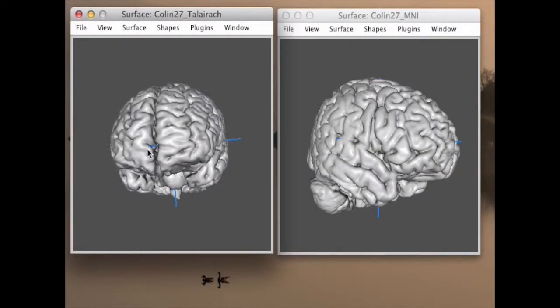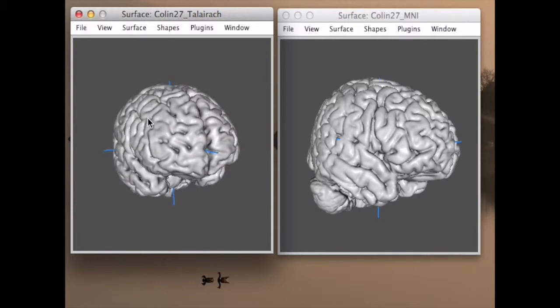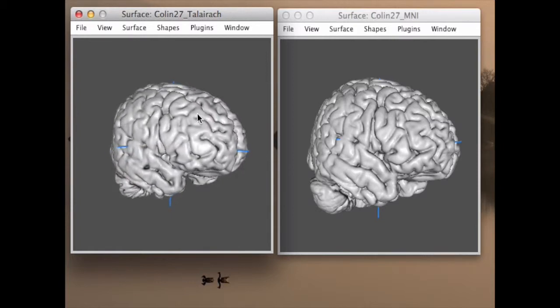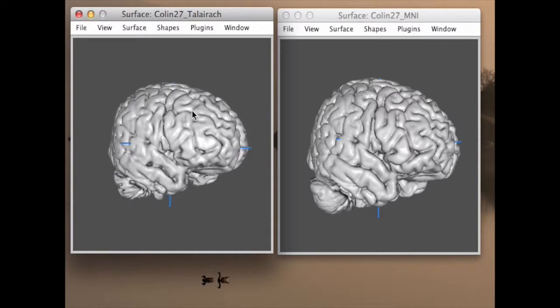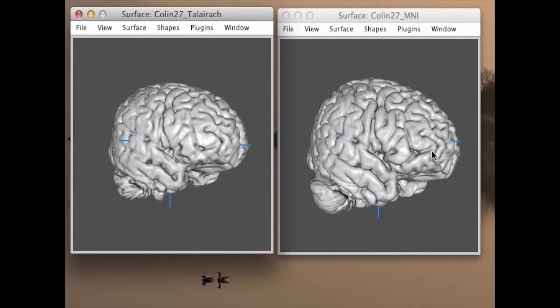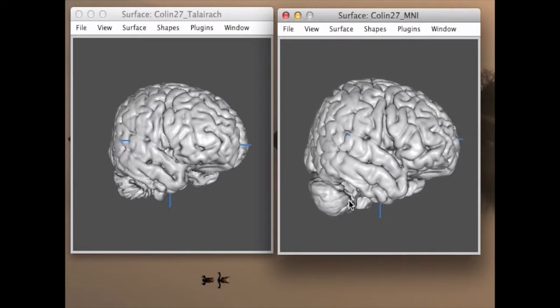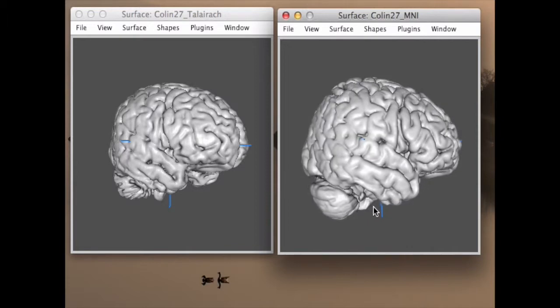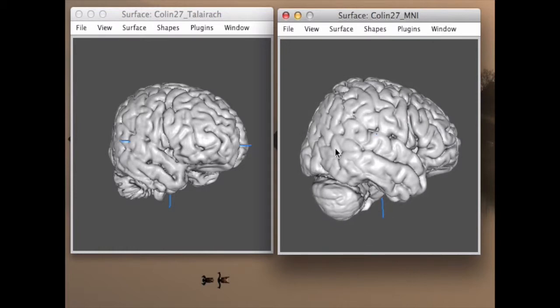Brain templates. Okay, so we're talking about how the individual subject's brain scans are aligned to make them more directly comparable. Differences can be due to differences in the resolution of the scanner, the positioning within the scanner, or the subject's brain size and shape. Most of these can be accommodated for with some rotation, resizing, and shifting. This realignment is called registering, co-registering, or transforming an image.